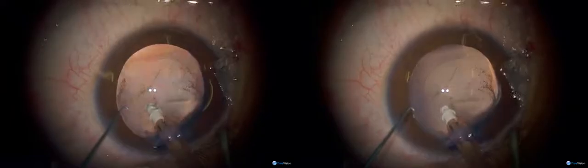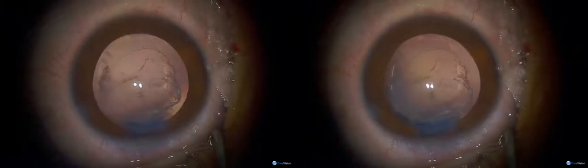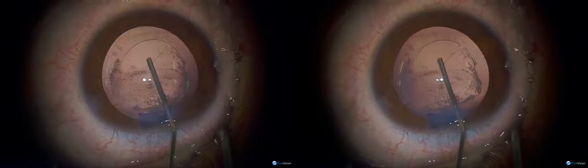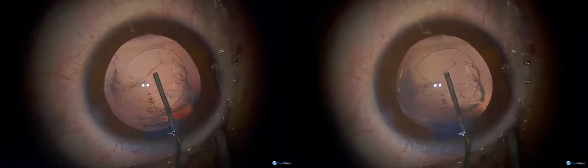He's already got a hole in the posterior capsule, which is what I was going to do anyway — I was going to make a primary posterior rhexis. So when the lens is in I'll just try and extend that hole behind the lens. I tend to use these lenses in children because the haptics are thinner and sometimes in children the capsular bag is too small. These lenses are not designed for injection but they can be injected through a C cartridge — the tip is a little bit wider than the D cartridge we use for adults.